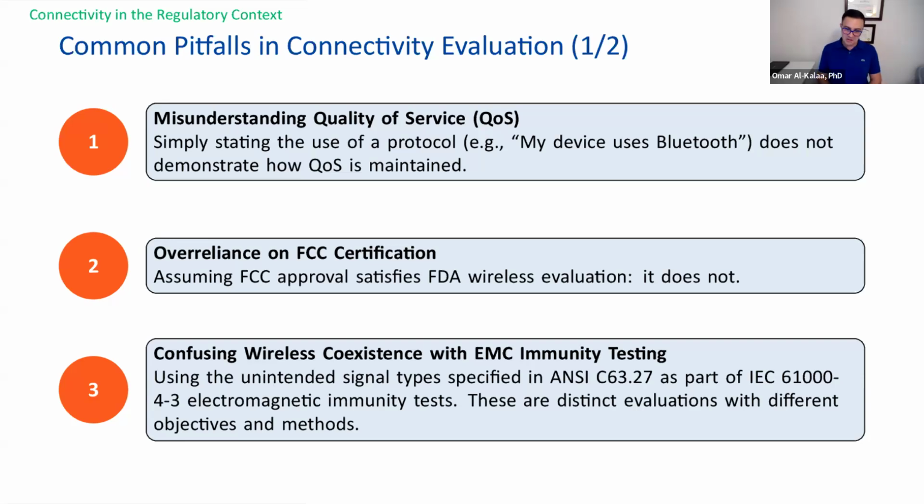The next very common point of confusion that, again, I continue to observe is confusing wireless coexistence testing with EMC immunity testing. EMC immunity has been tested for many, many years. There are a plethora of test labs out there providing EMC test services. And it is a very common practice. So manufacturers are used to checking the EMC box by sending their device to a test lab and saying, okay, give us back the reports.